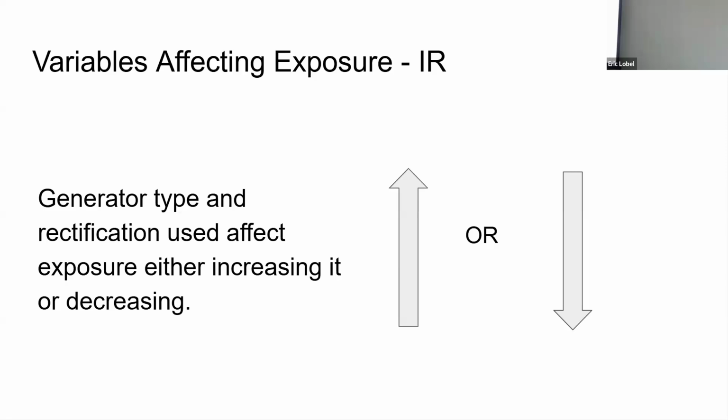When you go to a more efficient generator, you increase the percentage of photons that are actually at what you set. That's why you can lower the exposure if you go from a room that's single phase to a room that's high frequency. Because if you use the same exposure in a low phase room generator, and then use that same technique in a room with a more efficient generator, let's say triple phase or high frequency, you've overexposed the patient. And this is bad because the image gets fixed and it looks good, right? But you've overexposed the patient. And maybe that shows up in the DI.